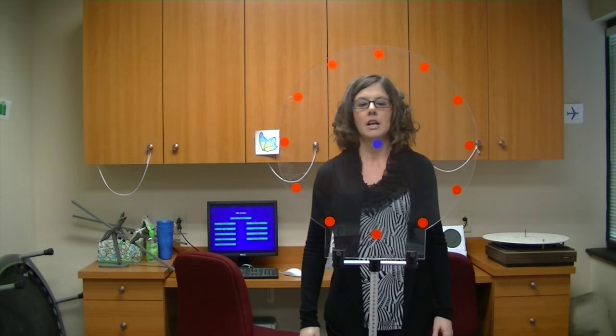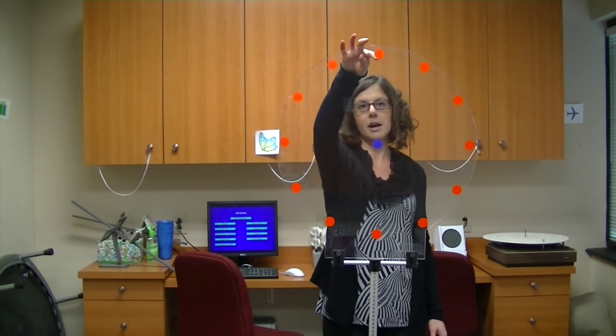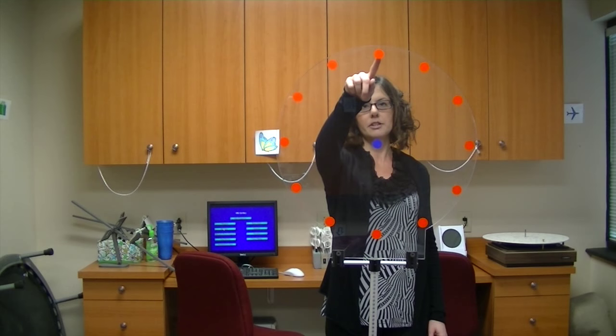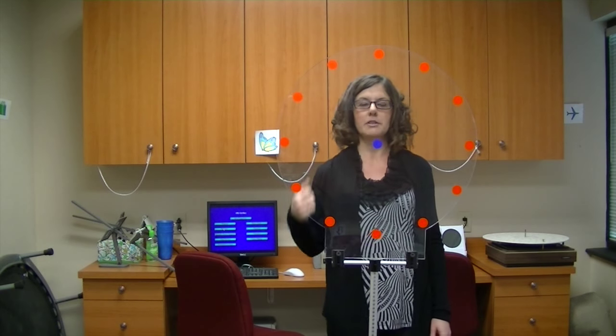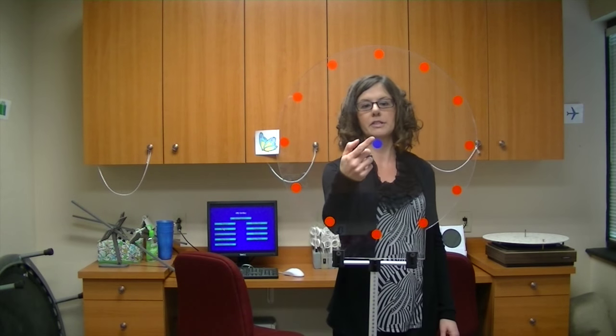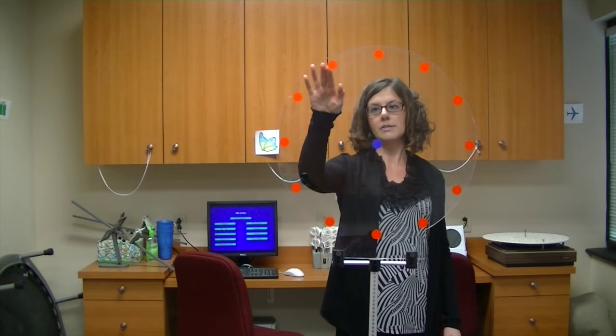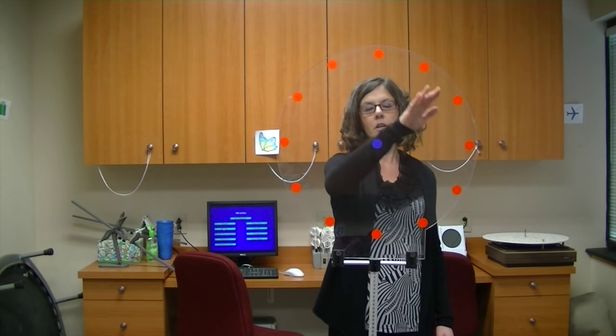And as they start off, they stare in the center. They look up at the dot, up at the top. They bring the arm up to touch. When they say touch, they say return, returns the arm, and it returns the eye. And then they go on as though they're going around a clock dial and do all of the other dots as well.